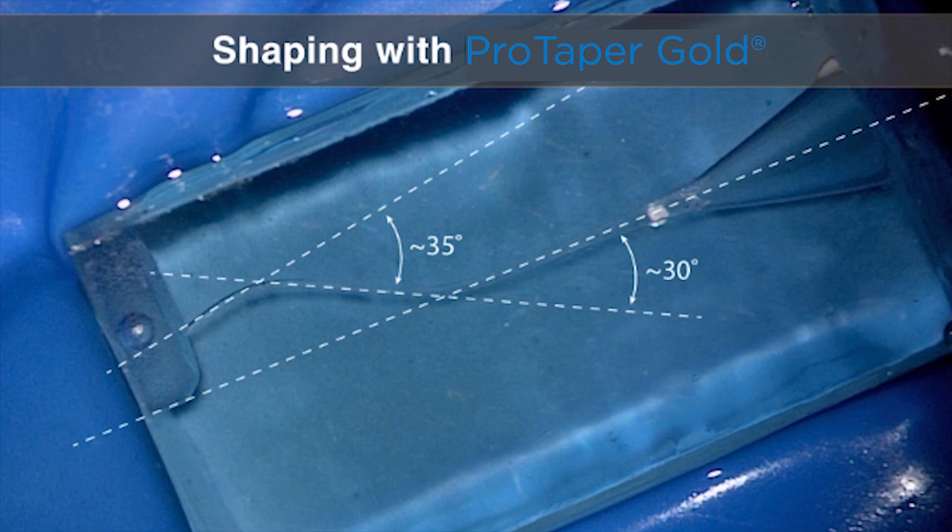Normally we would clinically use a viscous chelator as we begin to do our glide path procedures, but in plastic we'll just use 70% isopropyl alcohol. Notice the access is done and we'll just use the straight international most utilized files — purple, white, yellow, red. That means we won't use SX in this case, but we would clinically if it was a lot longer block, as that would really help us achieve length. So just use the S1, the S2, and then two finishers, F1 and F2.